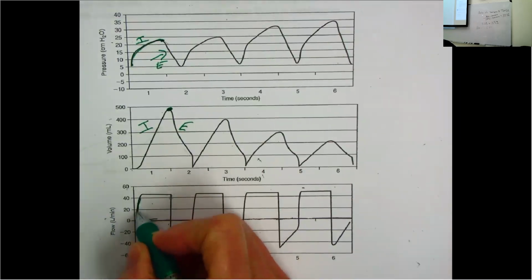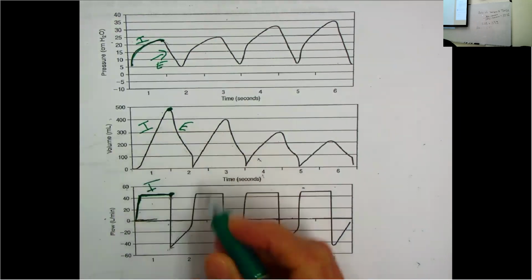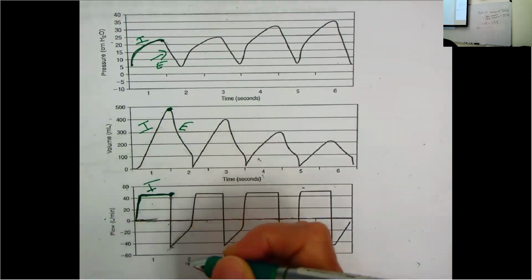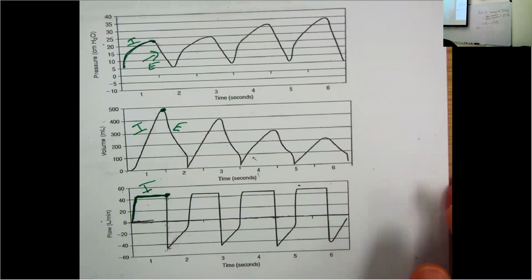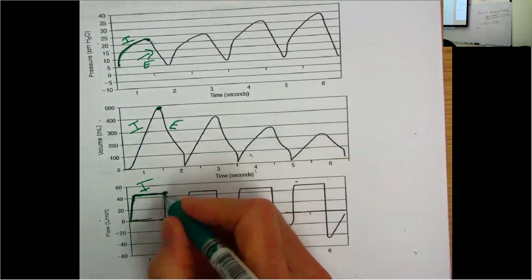So, with this patient, would this be a cause for concern? Pressure is rising with each breath, but volume is decreasing with each breath? Yes, that is a concern.